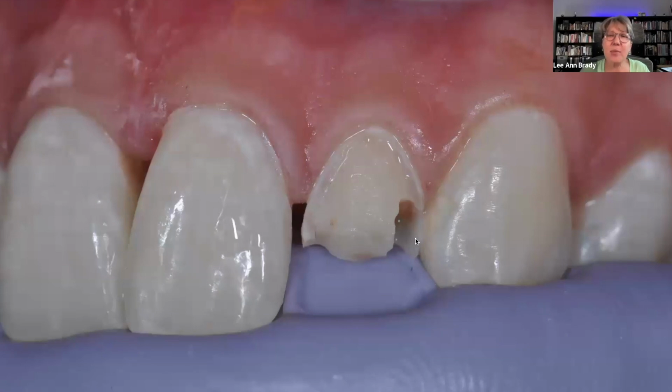And I did that because if you look at her natural teeth, you're going to notice that she has lots and lots of these sort of mesial to distal bands of decalcification and of color. I'm going to try to build that in with some stain when I do this composite.